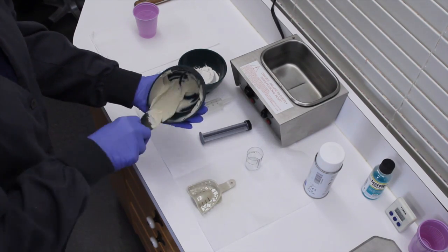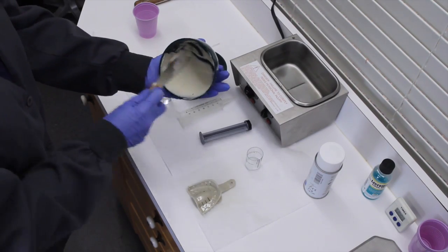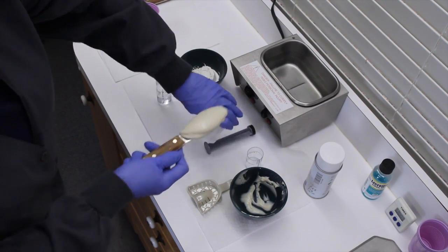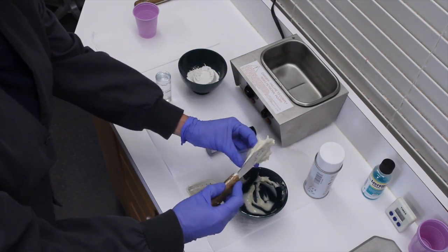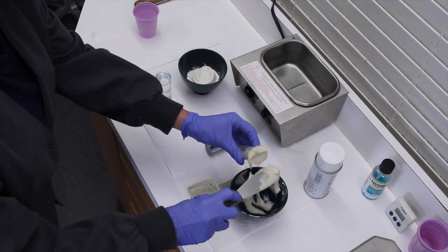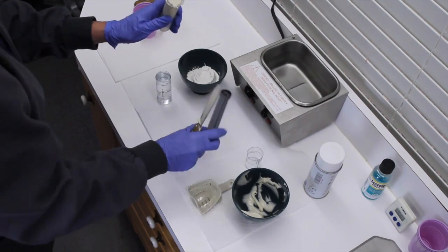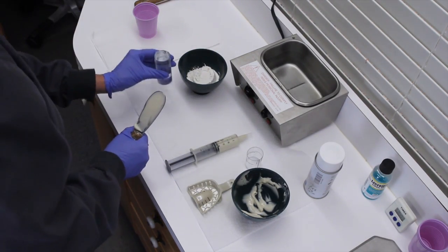So she's mixing. The most important thing here, of course, is to have a nice, smooth, homogeneous mix. And again, with the working time we have, with the water temperature, this does a nice job. Now, if she is working with me, as we will do in the demonstration, after she fills that, she's going to hand that to me. If she's working by herself, she's going to very simply, as she will show here, load the syringe and set that aside, and then mix the high viscosity.